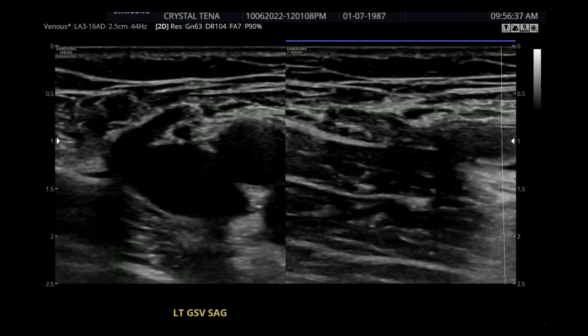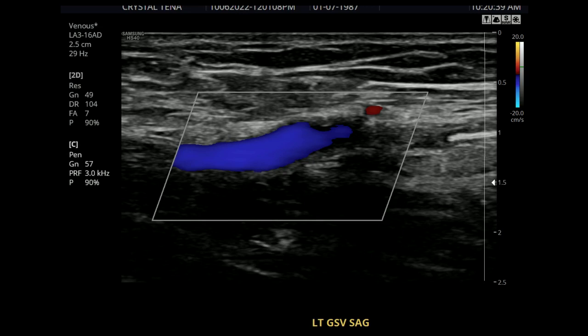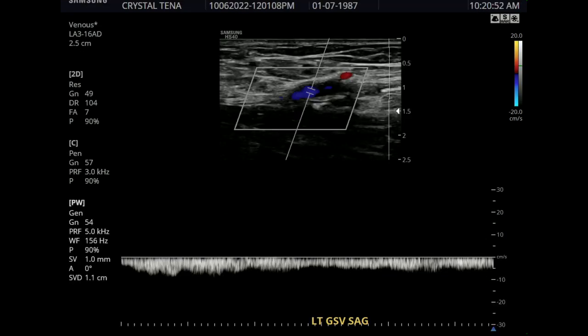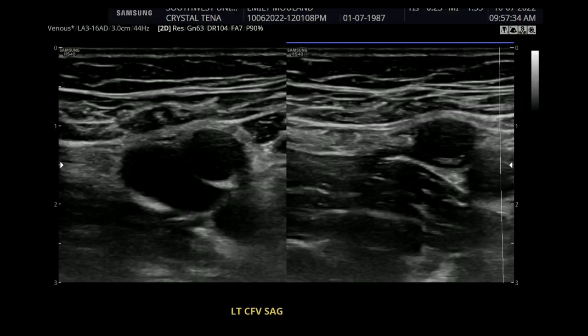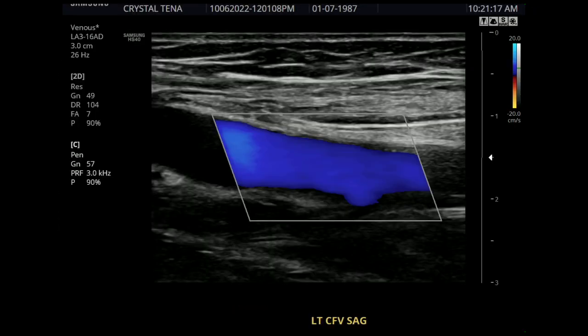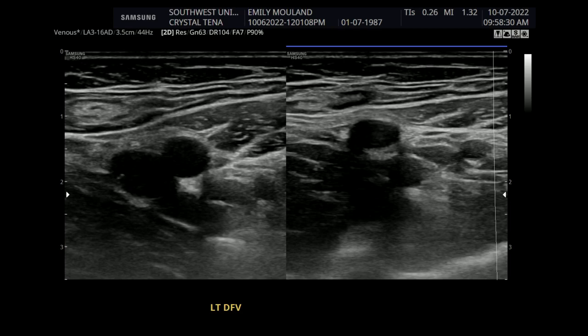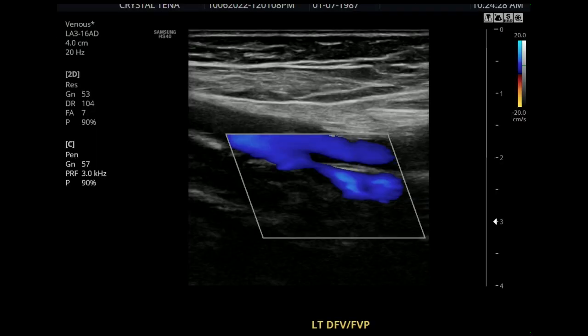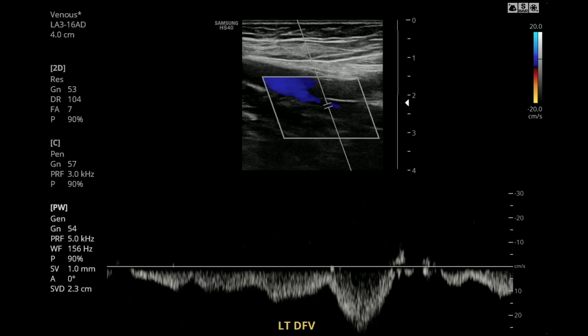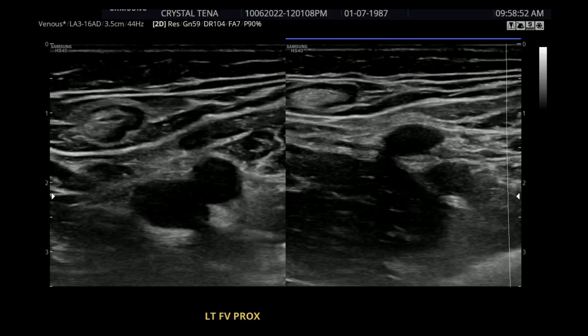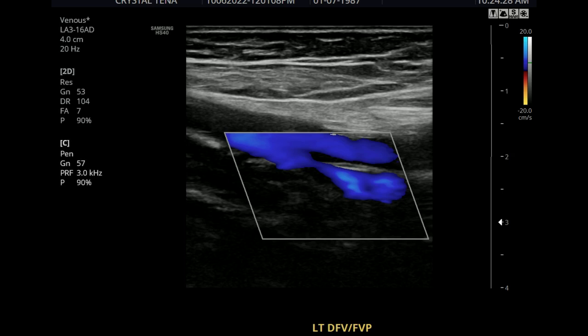These next images are going to go by quicker because they're pretty much the same thing except it's for the left leg. The left can be more difficult to scan because we're on the other side — we're closer to the right leg than we are to the left. To augment, it's quite a challenge. You could either position yourself somewhere closer, go to the other side, or ask somebody to help you.